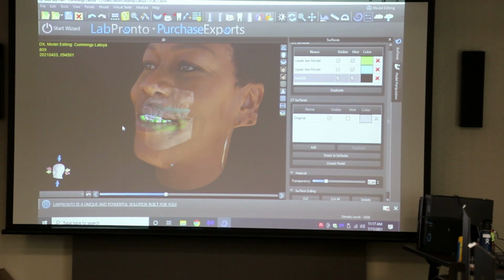Her nose is not visible, but her chin is out, like a class 3 patient. We use that for diagnosis and patient education. So now you can kind of digitize the patient. How did you see that? And you get it kind of close, like up there?